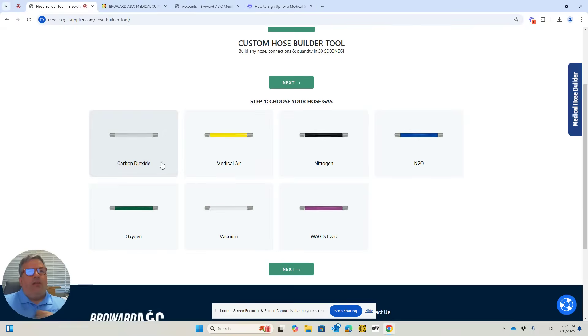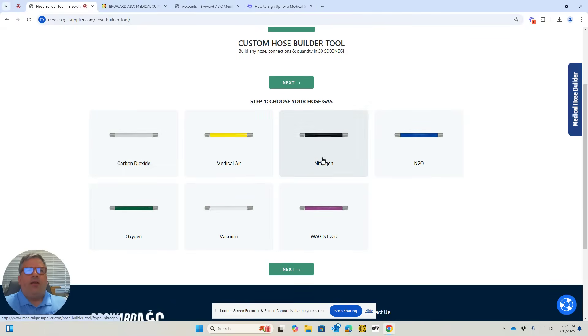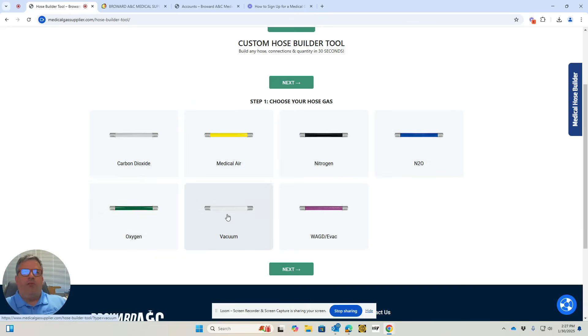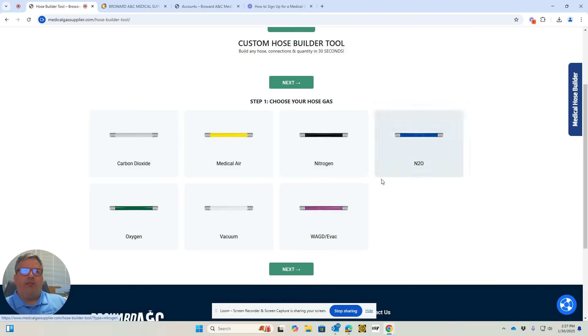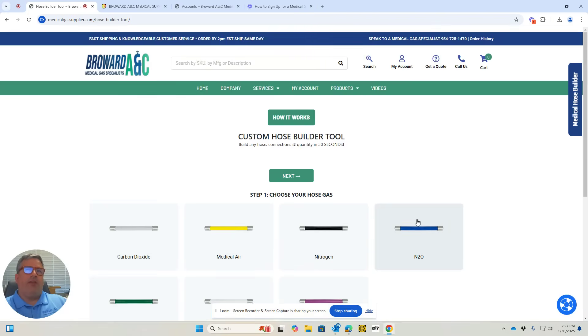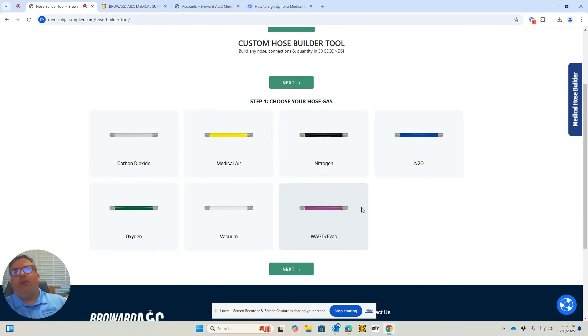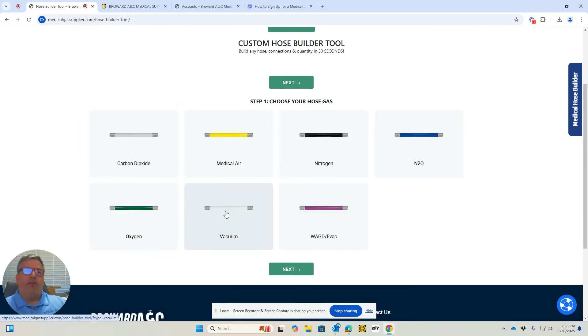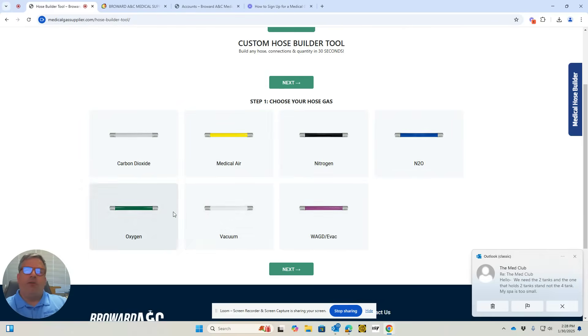You're going to have all your gases listed here. The most common ones are oxygen, medical air, nitrous, and vacuum. We have several other gases here. We don't have everything, but for the most part, it covers most of what people are looking for.